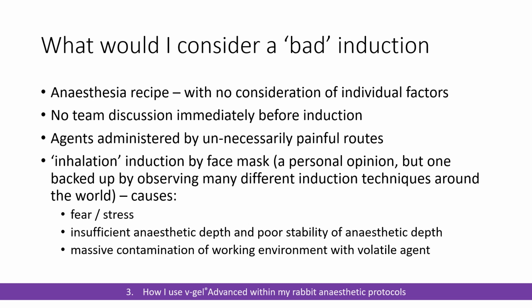And realistically, intravenous inductions are simple, they're easy. It's what we're all doing for dog and cat anaesthesia anyway. And once you've switched over from inhalation induction to intravenous induction, I think it's very unlikely that you'd go back again.